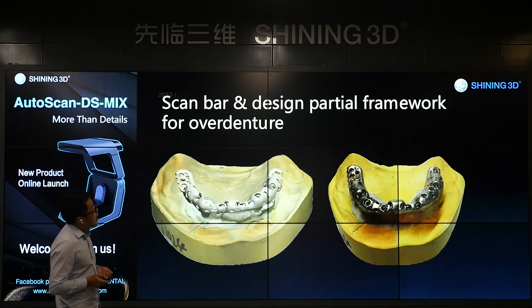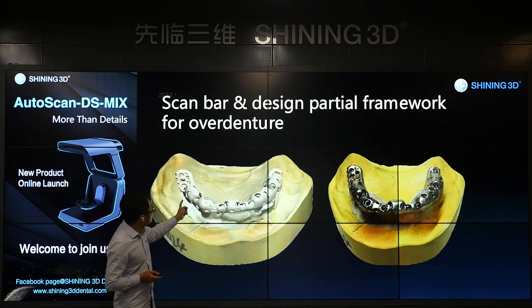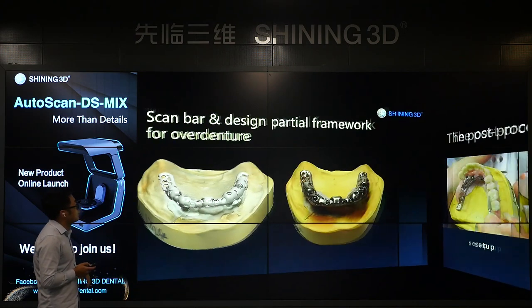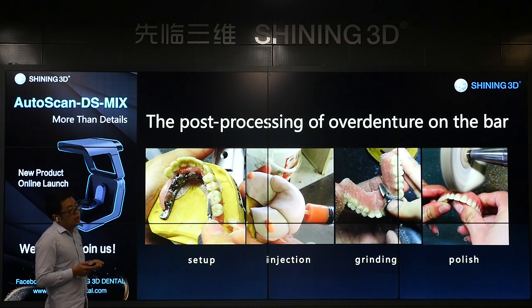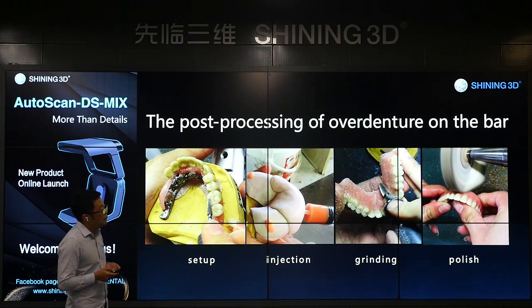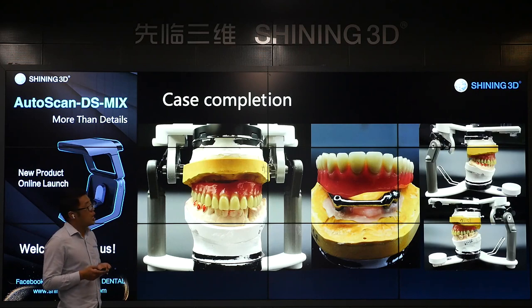Then design the partial framework on the bar. You can see here is the bar. And we need to design the framework, partial framework on the bar. After we get the bar, then we need to set up acrylic disc, then inject the acrylic. After that, we need to grind the acrylic, then polish, get the whole case. Also, it's a very great, beautiful, and shiny case.